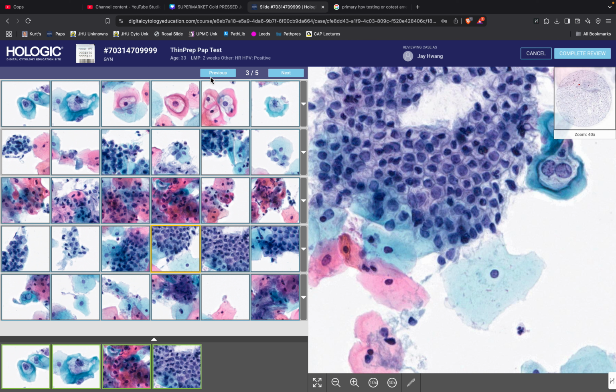Before we delve into pap smears, right now the date is June 2025. The American Cancer Society's most recent recommendation is primary HPV screening in women 25 years or older. So the HPV screening is important to look for high risk HPV subtypes like 16, 18, 31, 33. And if you have a high risk subtype, then you can directly go to colposcopy.